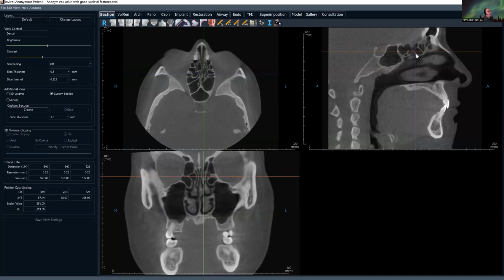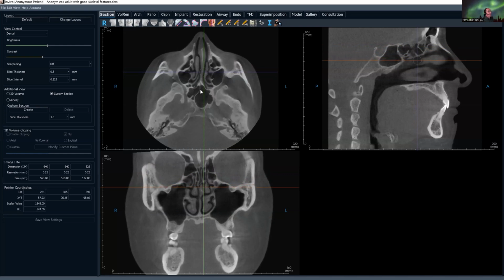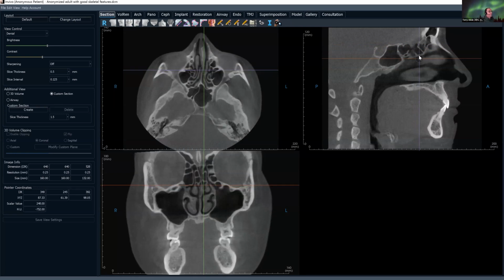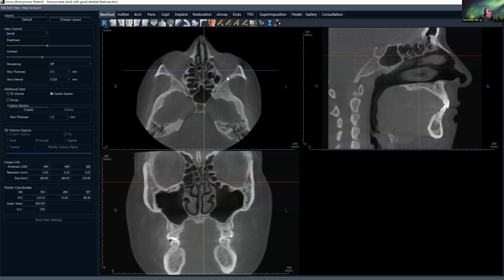And as soon as the superior orbital fissure closes, we're going to see rotundum open. So this is foramen rotundum. This is a beautiful looking example of foramen rotundum. Also, I want to scroll up here a tiny bit as well, right at this point here. At this point here, we see the pterygomaxillary fissure and the roof of the pterygomaxillary fossa. So this is an important anatomic structure because these cranial nerves that I just touched on a moment ago live in this area between the sphenoid bone and the posterior aspect of the maxilla.